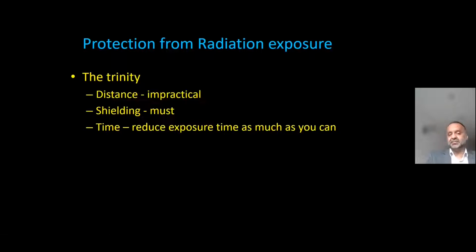Shielding, as I have said, is a must. If you're going to be doing this regularly for the rest of your professional life, you must shield yourself and then reduce the exposure time as much as you can. It will help you reduce your exposure, your patient's, and your staff's.